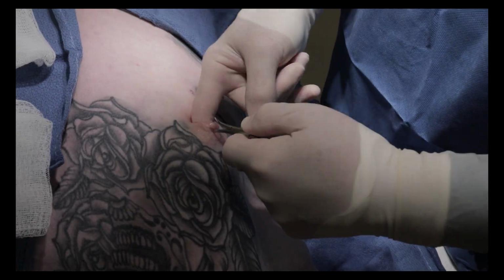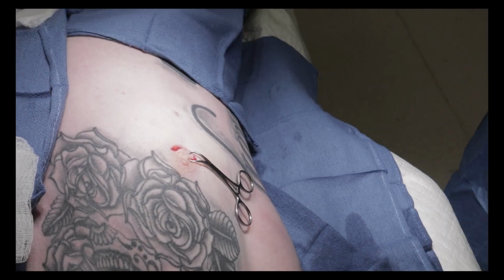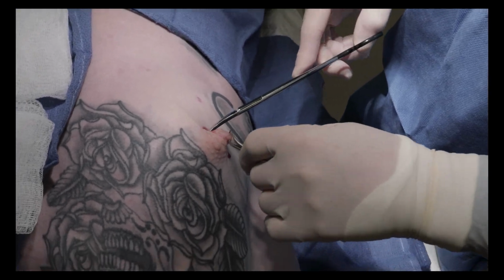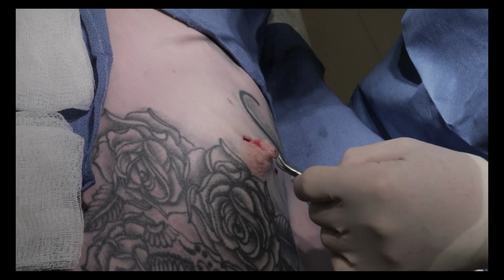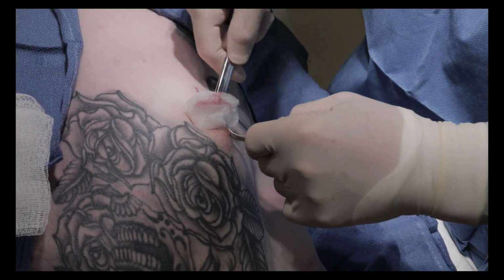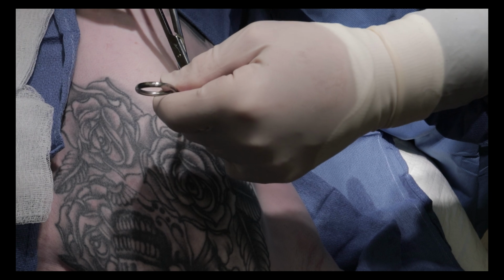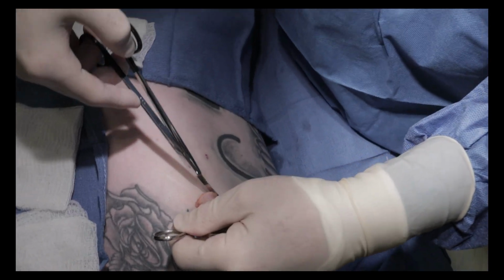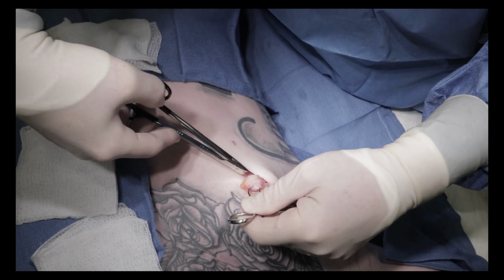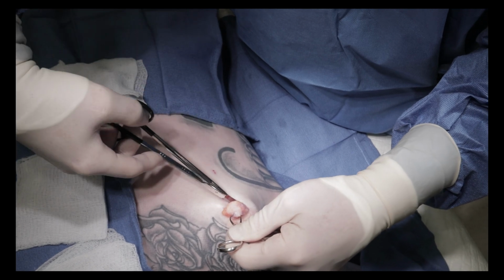And I can feel the tail of it right there. Gotta do a little bit more work on that. But when that's done, all good. Oh yeah. Nice. I can start to go into the head of it a little freer. Around it. So the juice. Good. And I can feel these scissors are kind of an extension of my fingers in my mind. So I can feel what is gland and what's fat.